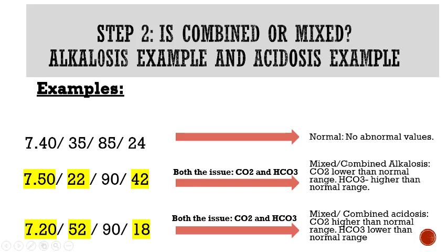So this would be a mixed or combined alkalosis. Your CO2 is lower than normal, your bicarb is higher than normal. They're both to blame for this out of balance pH.